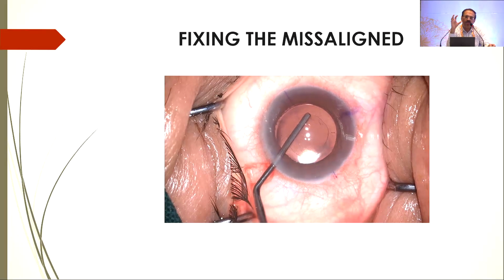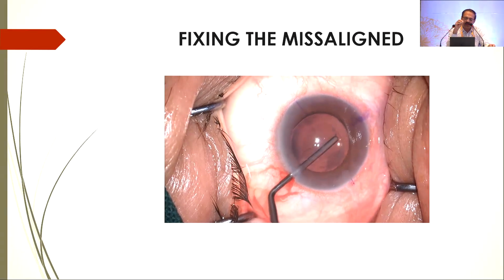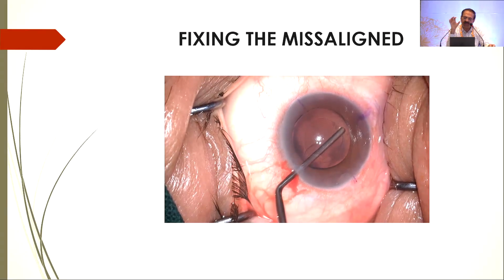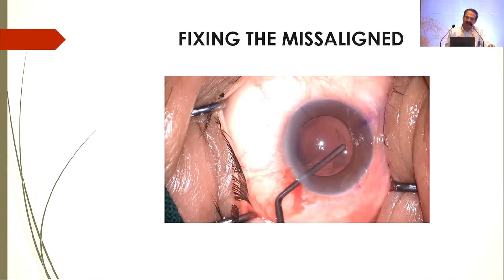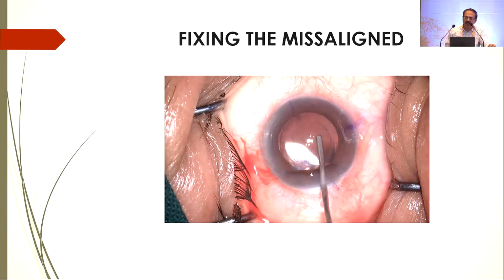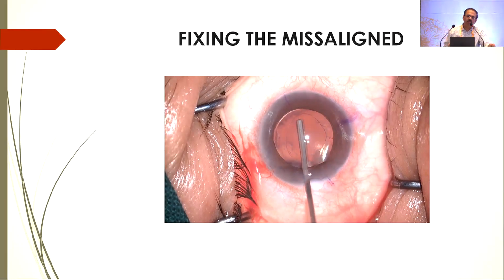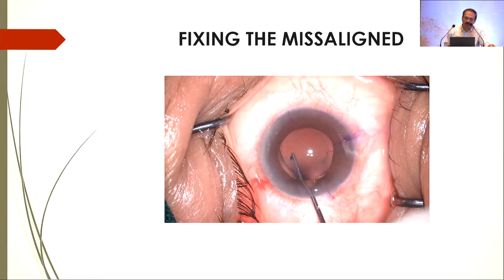As it was about a 2 week old surgery, we had to carefully nudge the rhexis margin and dissect the IOL from the anterior surface, clearly separating it in a very careful way so that the PC is not ruptured.